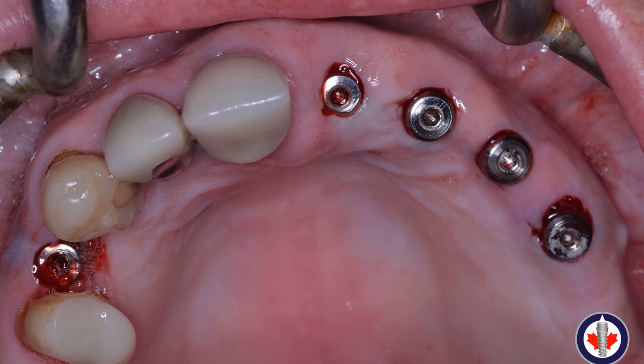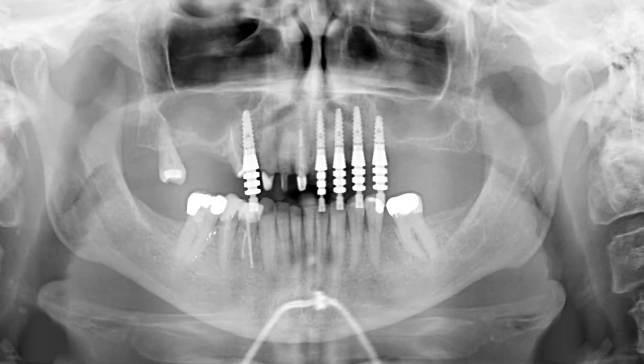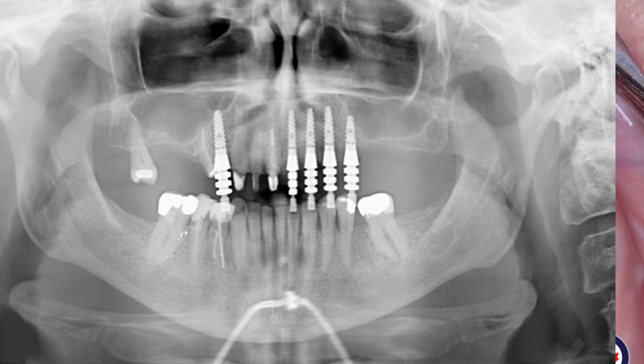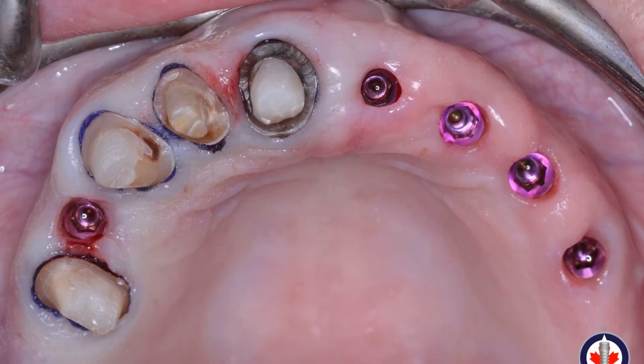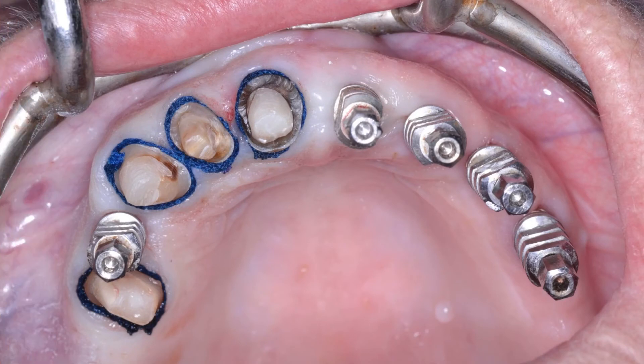At the Stage 2 procedure, we go ahead and place healing abutments. You can see that the 3mm straight healing abutments are seated nicely. When the patient returns, we remove the crowns planned on the maxillary right — there were some fairly aggressive preparations on those prostheses that we cleaned up. A panoramic radiograph is taken to confirm the healing abutments are seated and to check for any new periapical lesions.